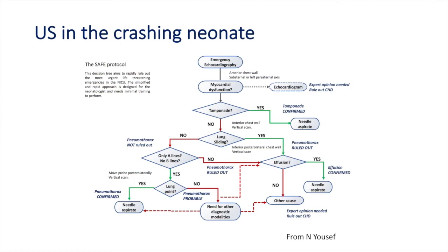And finally, there are now more and more algorithms being developed. It's been used extensively already in adults and pediatrics, and with Nadia Youssef, we developed this algorithm named the SAFE protocol. It's a very simple algorithm that allows you in less than 2 minutes to exclude all neonatal emergencies. Here we have the SAFE protocol, and we've just presented at the last launch the SAFER protocol, which includes the full body.